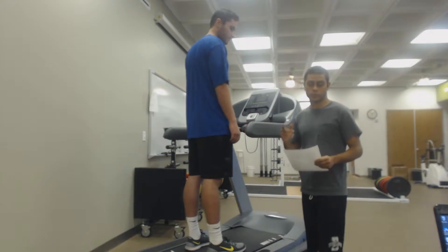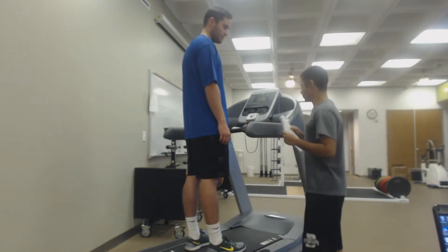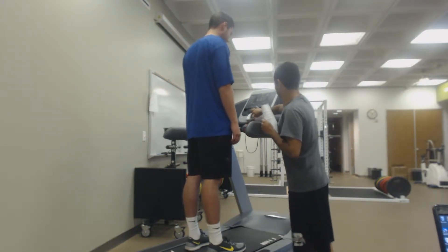For stage one, we're going 1.7 miles per hour at 10% grade. So we'll be starting stage one. Are you ready? Ready.